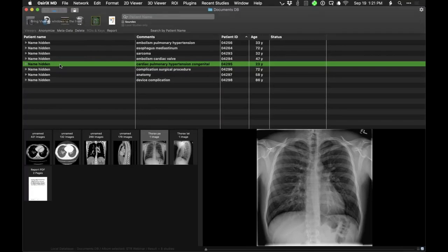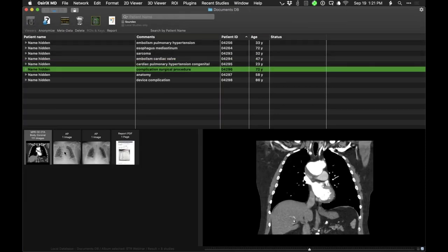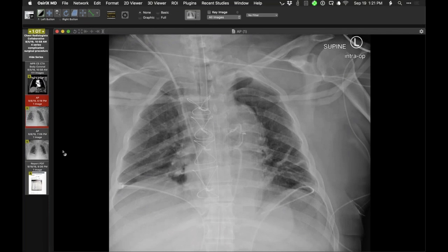So that's a nice kind of subtle case, but a nice one. This is something we always kind of talk about. So we have someone that has surgery, and I don't know about the policy in your hospital, but often hospitals have a policy of getting intraoperative radiography if the operation lasts longer than a certain period of time. Or of course, if needle counts are off or sponge counts are off, we have intraoperative radiography like this. This being in the context of thoracic surgery and aortic surgery.